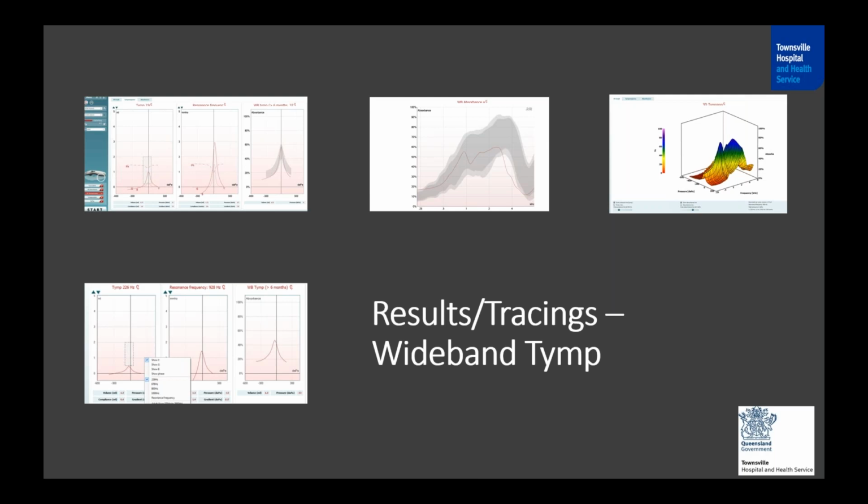It gives the results frequency-wise. It reminded me of all those virtual instruments, all those stacked tympanograms. Yeah. It is useful in a sense.